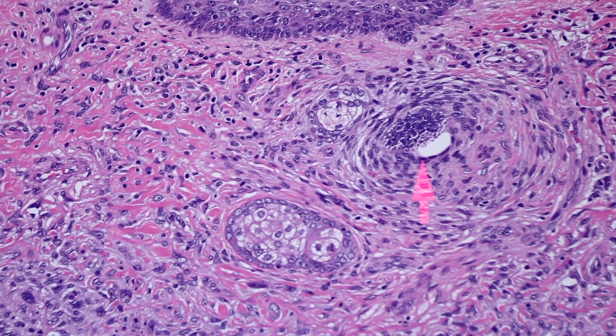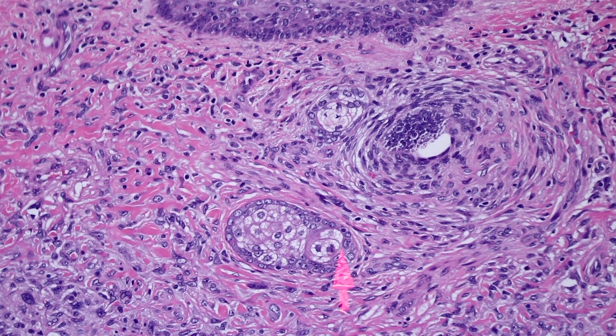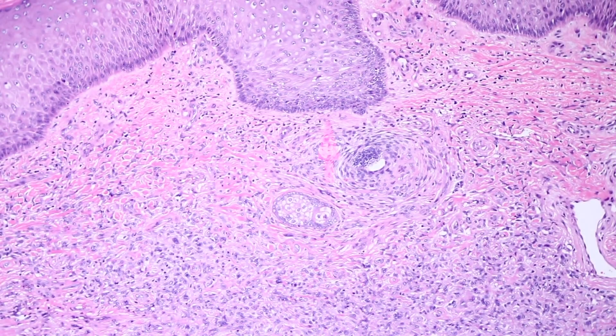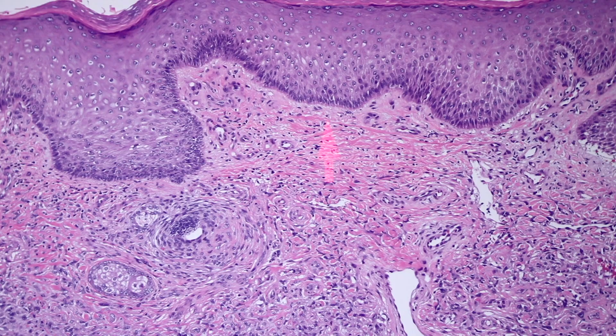It's like a little tiny hair follicle root and a couple of little baby sebaceous glands. So you can have follicles or sebaceous glands or a mixture of those, along with epidermal hyperplasia, overlying a Dermatofibroma.